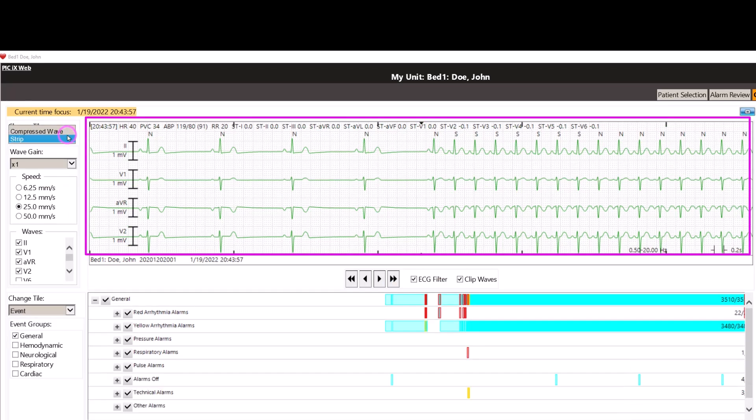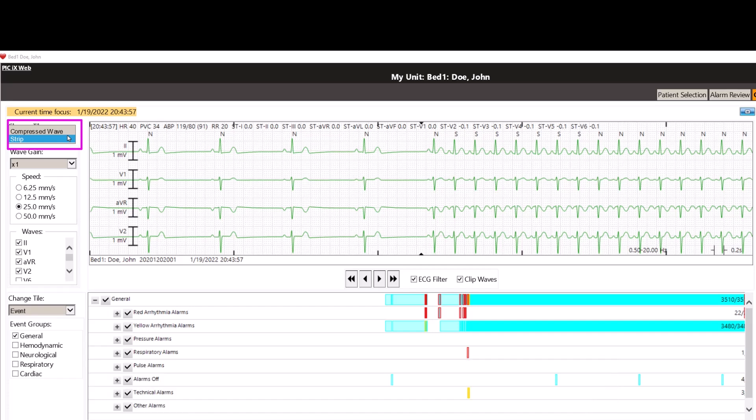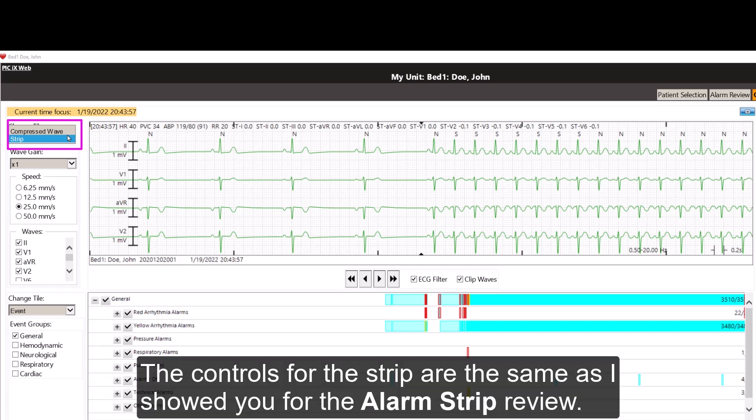Or change the top tile to a strip tile in the change tile drop box. The controls for the strip are the same as I showed you for the alarm strip review.